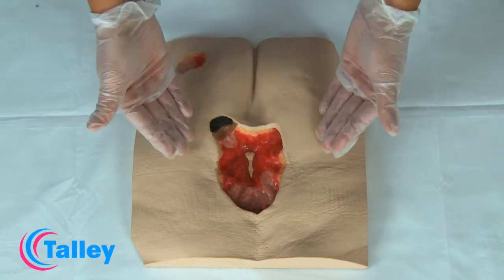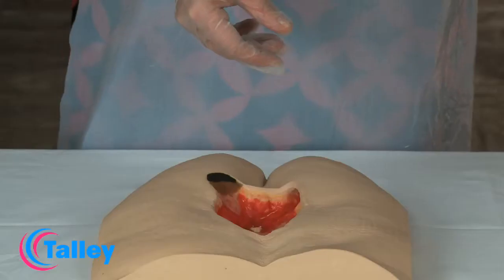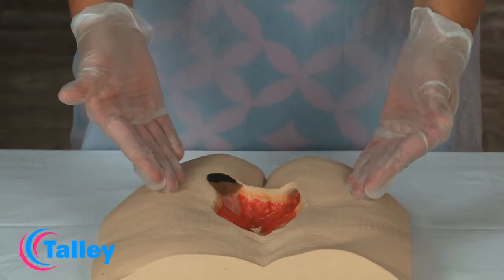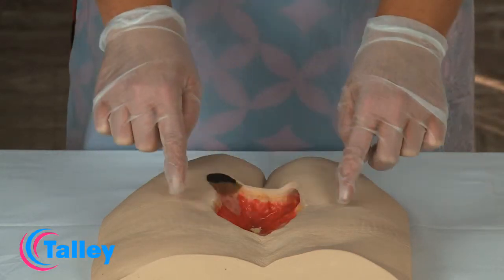Once the peri wound skin has been examined, you can then decide on the treatment which you want to apply. If the skin is intact and viable, it is not always necessary to apply any of the barrier protectants mentioned.